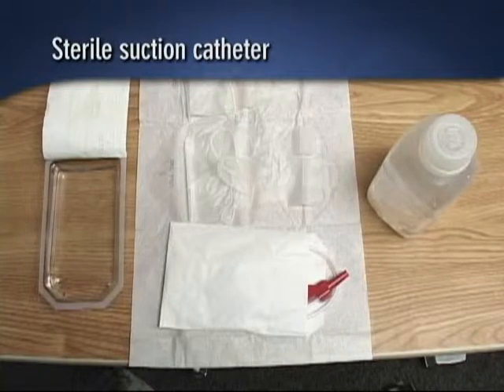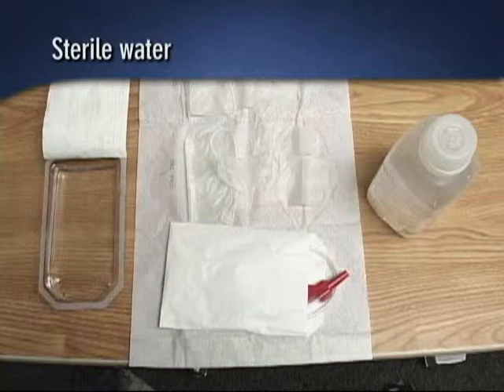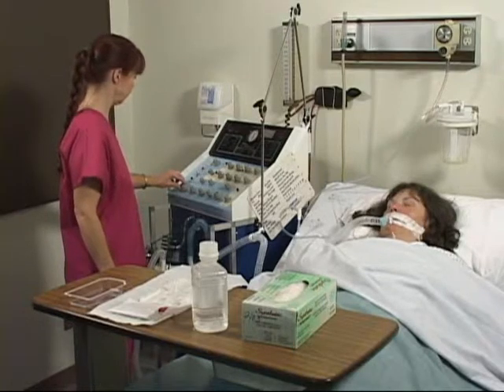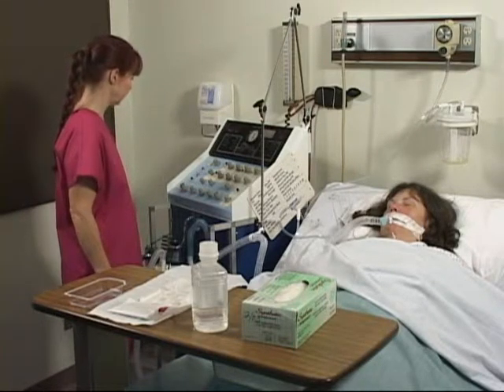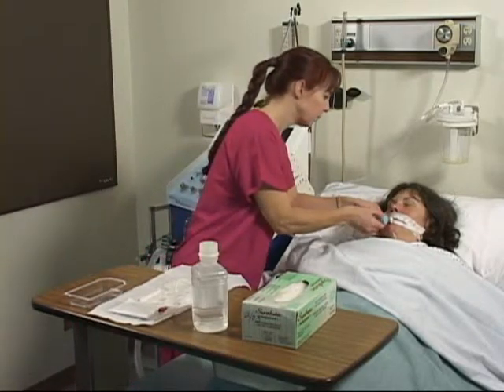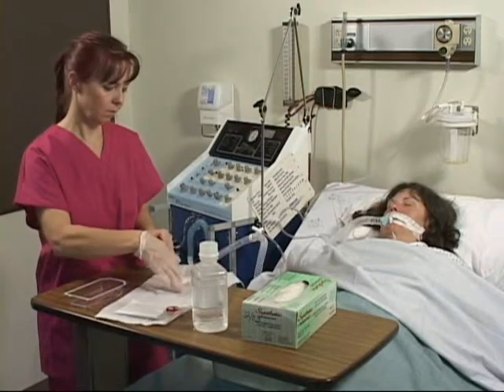Assemble the sterile suction catheter, sterile gloves, and sterile basin filled with sterile water on the bedside table. Pre-oxygenate the client as described earlier using the manual resuscitation bag or ventilator setting. Be sure the connection of the ventilator tubing to the endotracheal tube is loose enough to be released with one hand. Open and put on the sterile gloves.